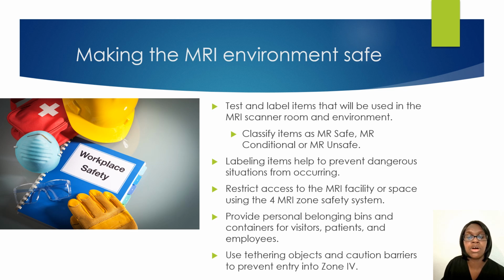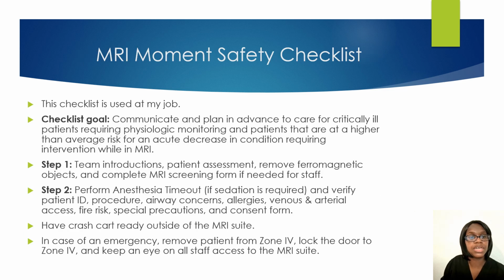Just make sure that you are providing personal belonging bins to patients or visitors so that they can put their items in that bin if they do not have a locker to lock it in. And just make sure everyone is being properly educated on patient safety or how far items can go in or outside of the room. You have your MRI safety checklist.